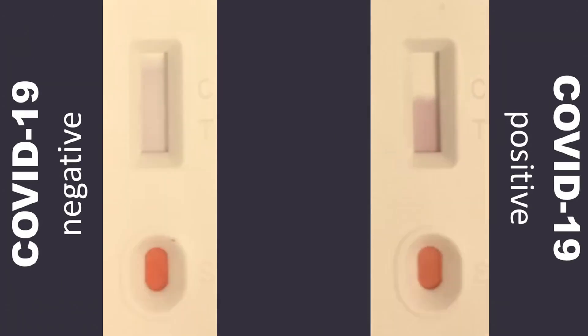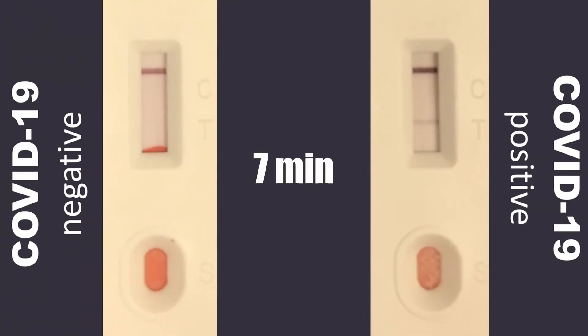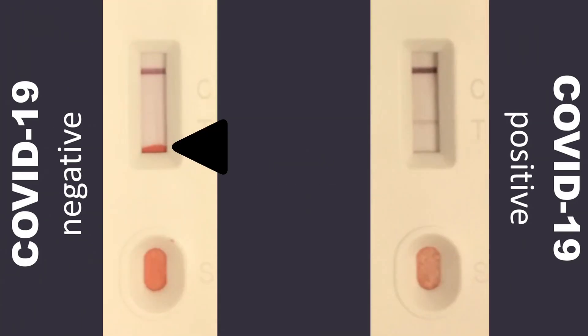This is a time course video taken of two tests run side by side using finger prick samples. On the left is a sample from a COVID-19 negative patient; on the right is a sample from a COVID-19 positive patient. The control line at the top of the cassette should appear — this line is for quality control and ensures that the assay is working properly. Red blood cells will migrate across the device slowly; read the results before the red blood cell front reaches the test line.